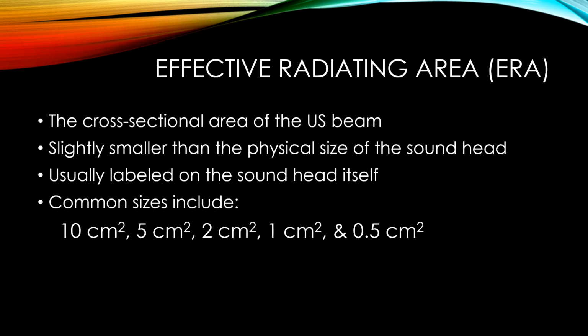Common sizes would include 10 square centimeter, 5 square centimeter, 2 square centimeter, 1 square centimeter, and I've also seen a half square centimeter ERA transducer.